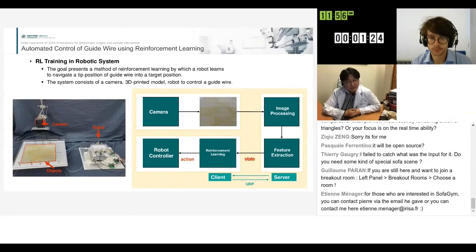Actually, as I recall correctly, last year at the SOFA Symposium, one German research institution, maybe Fraunhofer, presented their work as very similar to this one, and our work is a far humbler one than theirs. But anyway, we tried both computer simulation-based and physical phantom-based simulation to see the feasibility of automatic control by reinforcement learning.